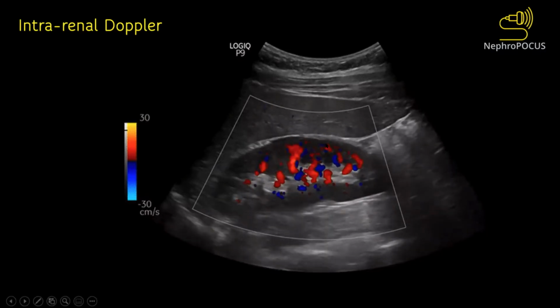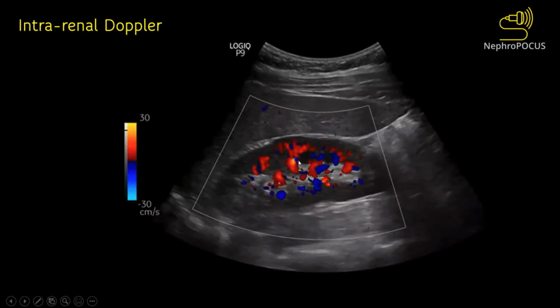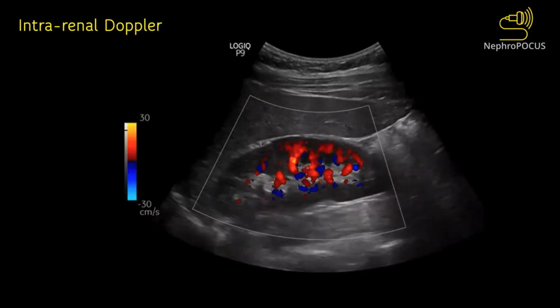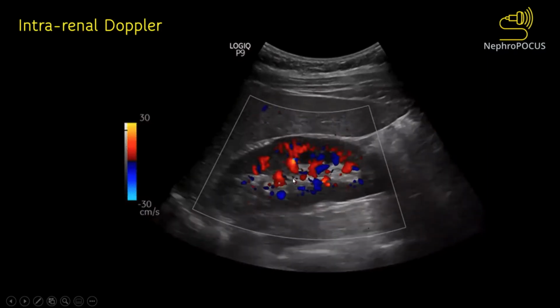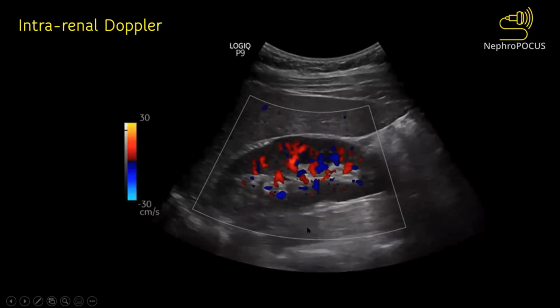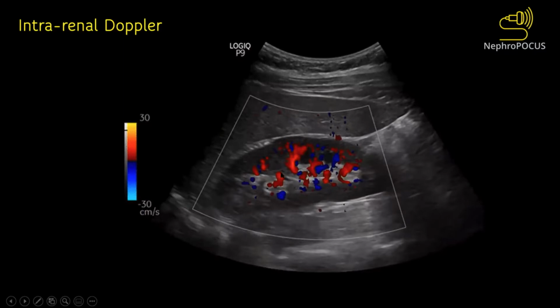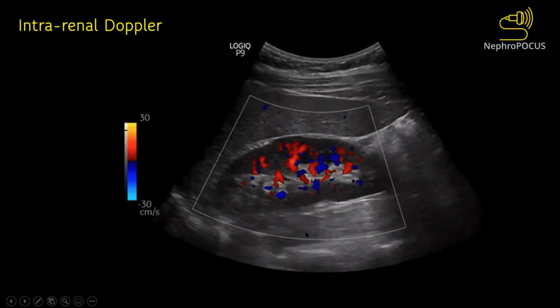So you would want to choose an intrarenal vessel, typically an interlobar vessel. Interlobar vessels are those just beside the renal pyramids, and then they loop around the pyramid as arcuate vessels. You can do it in either arcuate vessels or interlobar vessels, but if you look at the direction of the ultrasound beam, interlobar vessels are more parallel to the ultrasound beam, so you get a better image. And if not possible, you may still be able to do it in segmental vessels, a little downward here, but typically not anything outside the kidney.